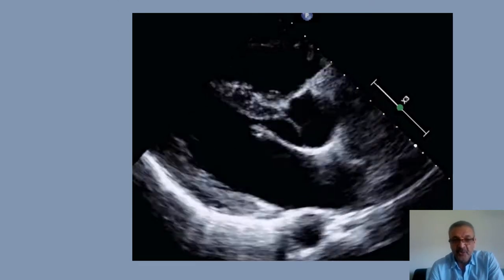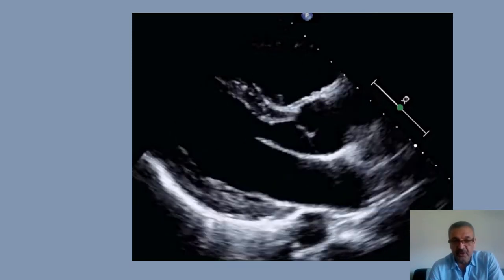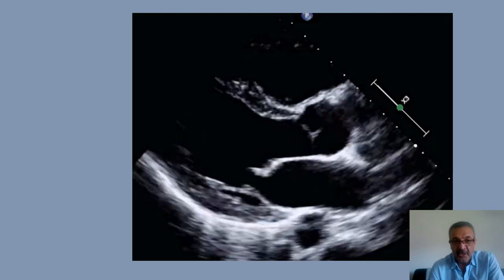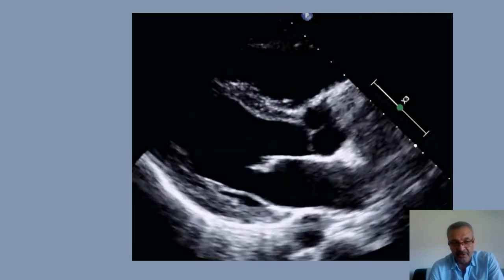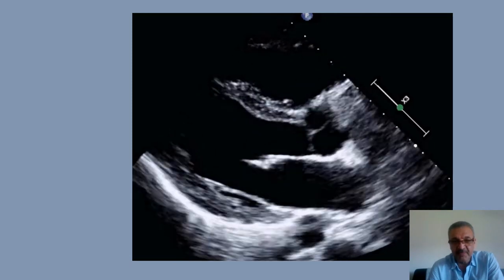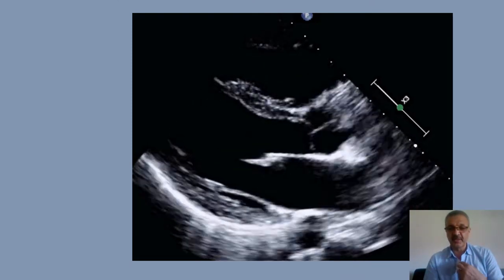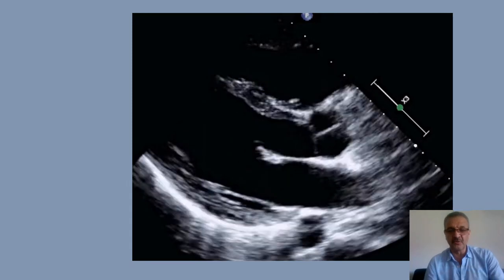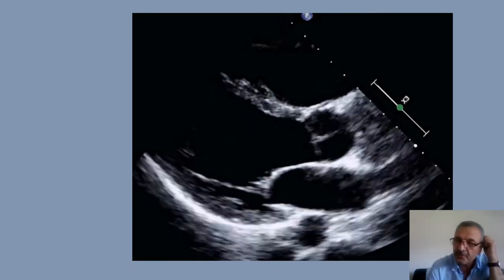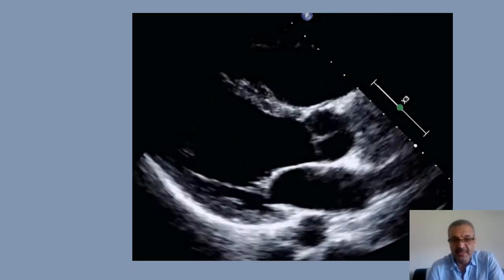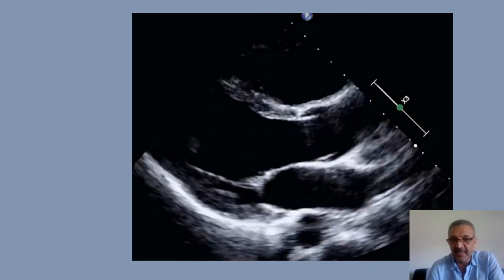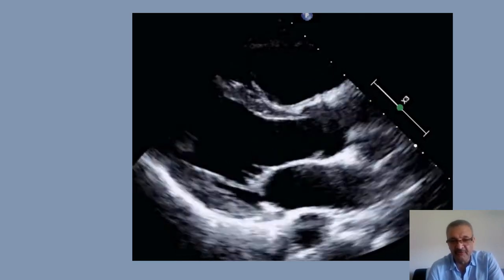Second, except for small or young patients like children, based on the sector width, you usually don't see the apex of the heart. So if you see the apex, you are too far toward the apex — just slide the probe toward the midline. This shows less left ventricle and more aorta, or vice versa.